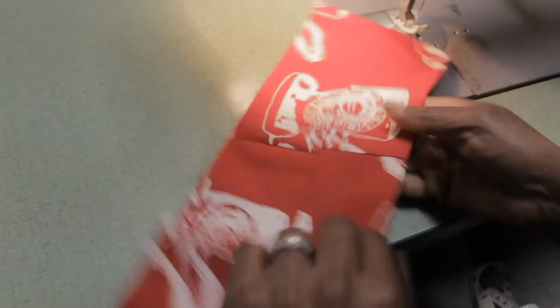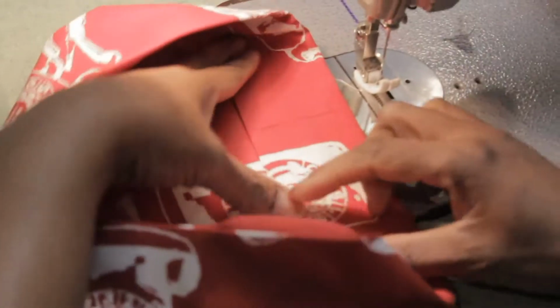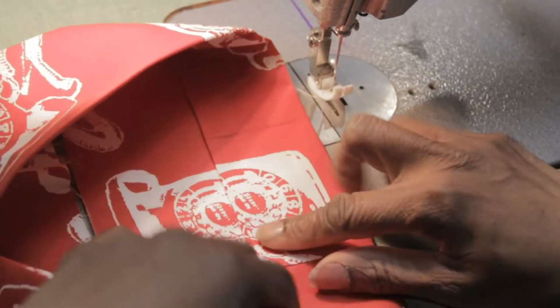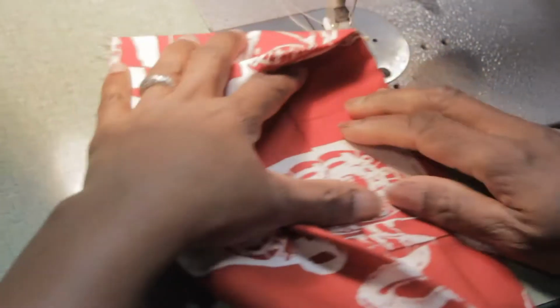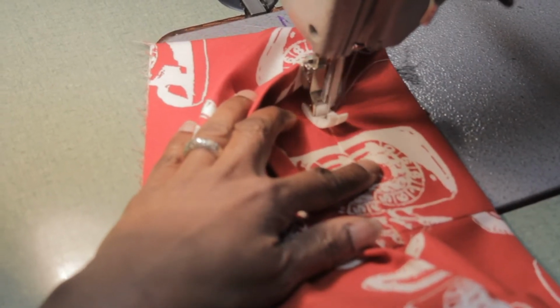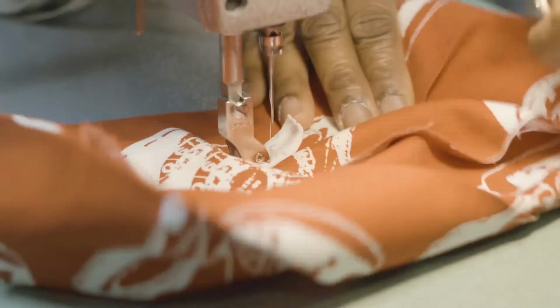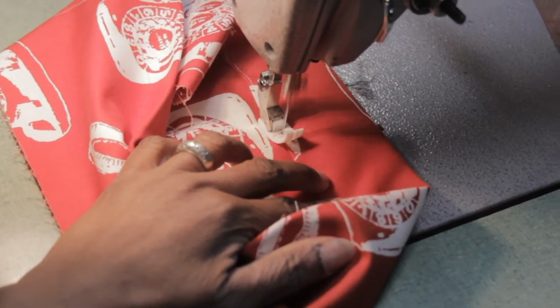And now we're going to put this under the machine, making sure not to catch the other side of the cap. And you're going to sew right at the edge here from this line to this line, back tacking at the beginning and the end of your seam. So we're just making a little bit of a casing to run our elastic. So we're going to start right at the edge, and we're just doing a straight line right to the edge there.